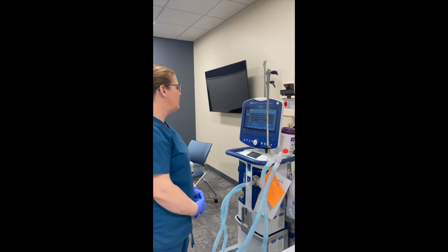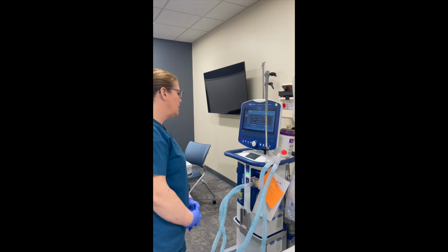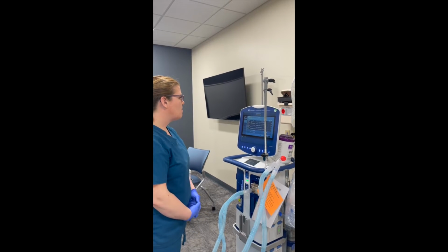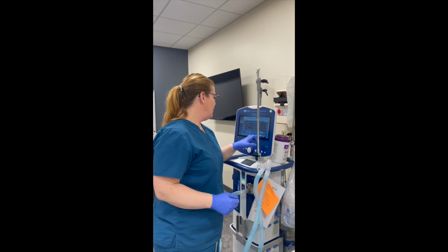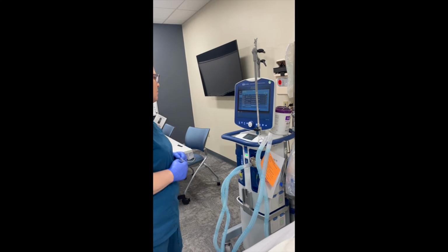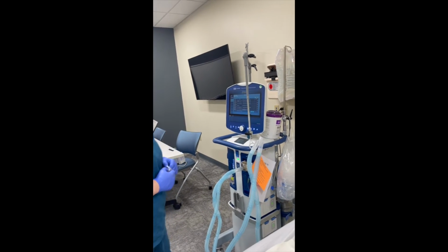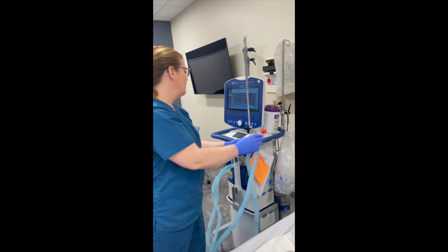Okay. Passing, going on to the next test. Checking circuit resistance. Okay, we're gonna unblock the Y. Accept. Okay, looks like that one has passed. Testing circuit compliance, so we're gonna block the Y again.